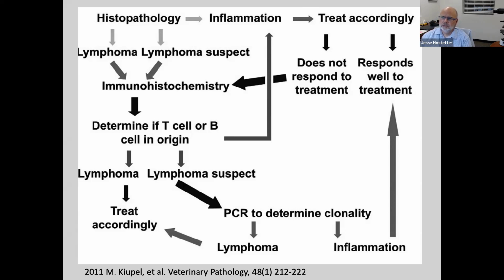After consulting with other pathologists, if it's 1, 2, or 3 cell layers of eosinophils deep below the crypt, I tend to ignore it. But if it's more than that, if it's 5, 10 layers of eosinophils deep to the crypt, and I start looking in the lamina propria and see, as I mentioned before, those clusters of eosinophils, 10, 20 in the lamina propria as well, then I start thinking that this is likely eosinophilic inflammation.